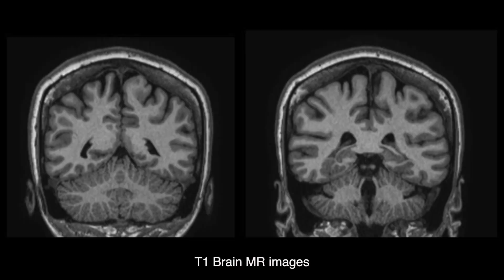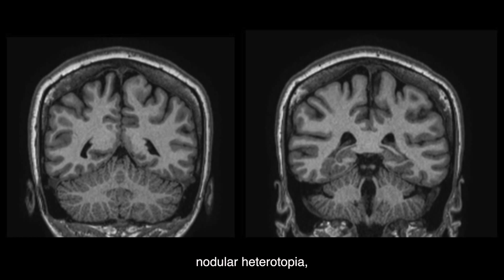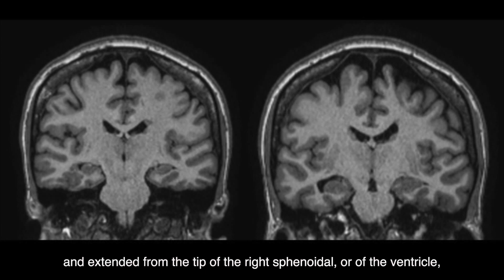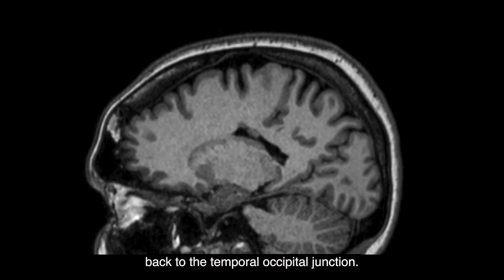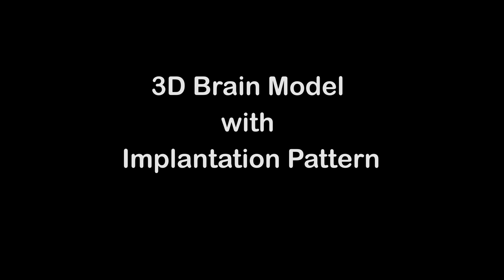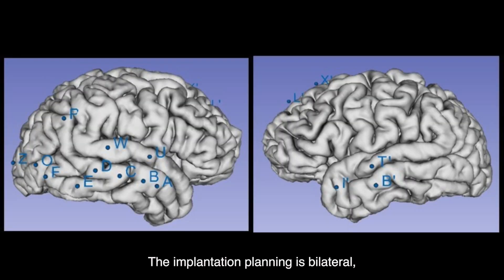T1 brain MRI images allow detection of bilateral periventricular nodular heterotopia, which is more evident on the right side and extends from the tip of the right sphenoidal horn of the ventricle back to the temporal-occipital junction. A contralateral nodule is visible at the level of the cella media. The implantation planning is bilateral, with particular attention to nodule coverage.